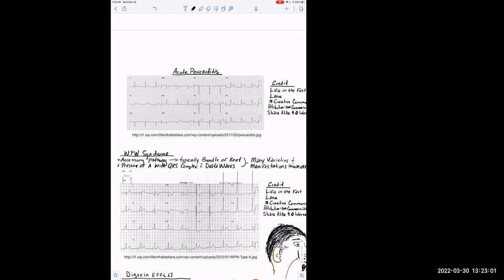The second thing that you're going to look for is when you do your EKG, in pericarditis, you will see ST segment elevation either globally, that means in all of your leads. So if we look at this EKG, we see ST segment elevation in II, we see ST segment elevation in III, we see it in your V leads, V5 and V6. So that's going to be global ST segment elevation. That's going to clue you in that, hey, in a STEMI, unless we're talking about a global MI, usually we don't see ST segment elevation in all leads. So that's going to be your first clue.